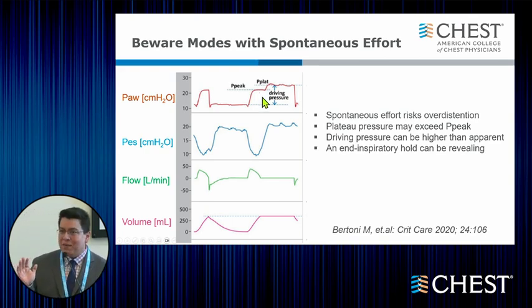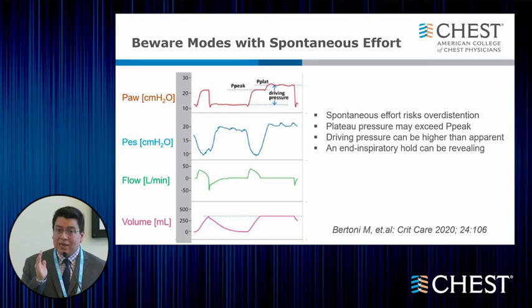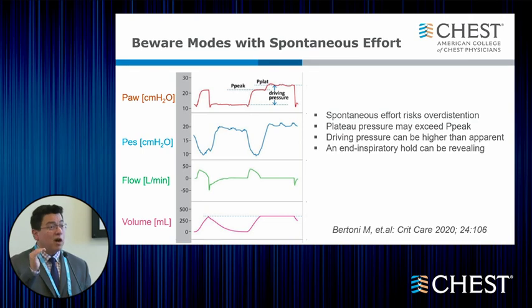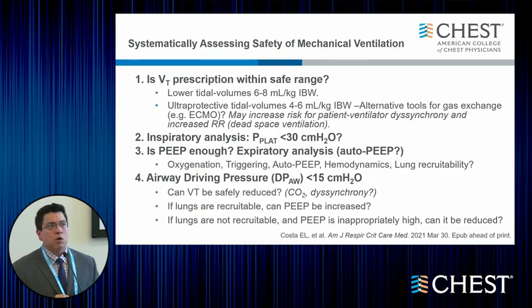The pressure that we might be seeing on the ventilator might be falsely reduced by the effort of the patient. So sometimes if we are able to inject an inspiratory pause in a spontaneous mode, you can actually see a much higher pressure under static conditions. And of course, that may affect your calculation of airway driving pressure in spontaneous modes.